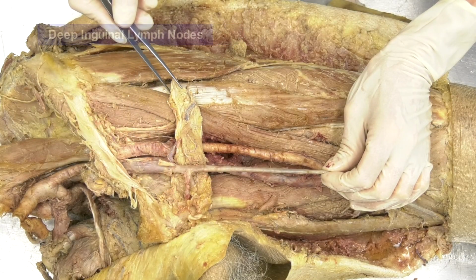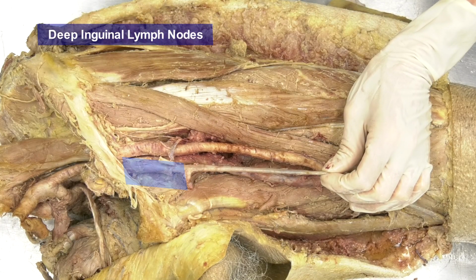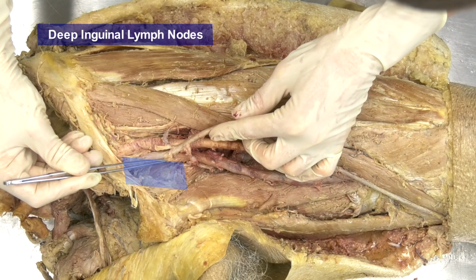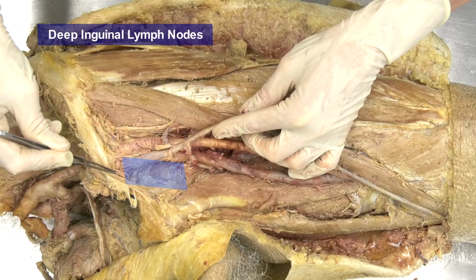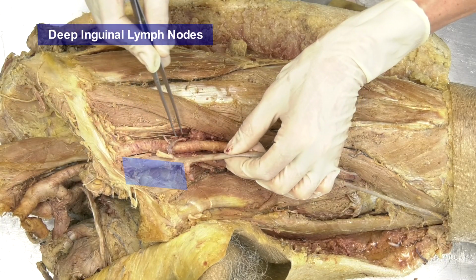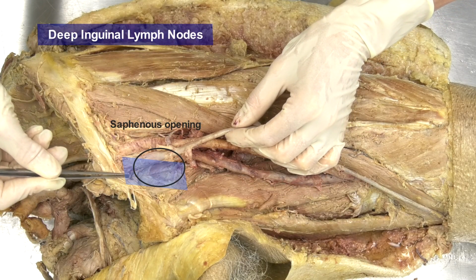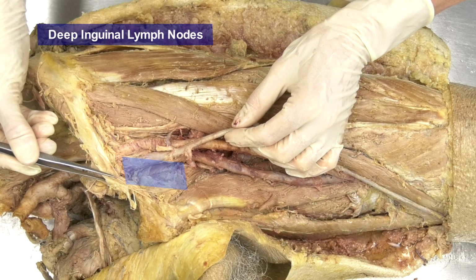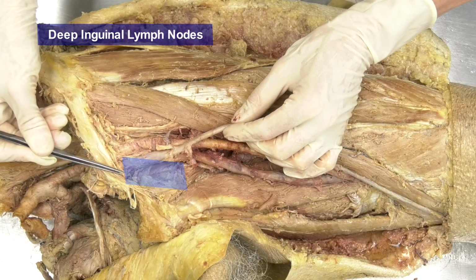Now we will focus on the deep lymph nodes, which are located medially from the common femoral vein above the level of saphenofemoral junction, or more precisely, above the lower margin of the saphenous opening. It is also called fossa ovalis. Cranially, the lymph nodes extend to the inguinal ligament, where the uppermost node is called the Rosenmüller or the Cloquet's node.